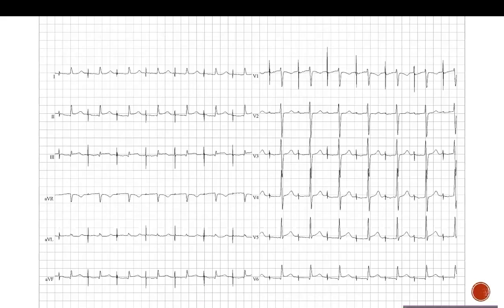You indirectly see the atrial capture. You don't see it morphologically on the ECG, but if there is no atrial capture, there's not going to be conduction to the ventricle. If the electrical impulse just didn't capture the atrium, it's going to die and nothing's going to happen. Right? Yes. Okay. Did you understand or not? Does anyone else have a question about it? Okay, I'll assume everyone understands it.